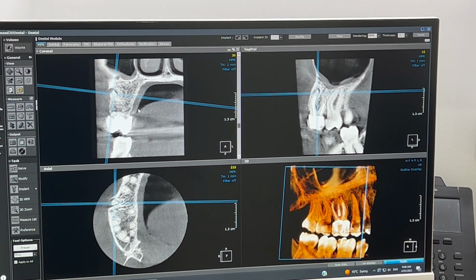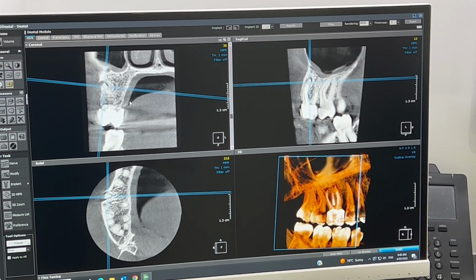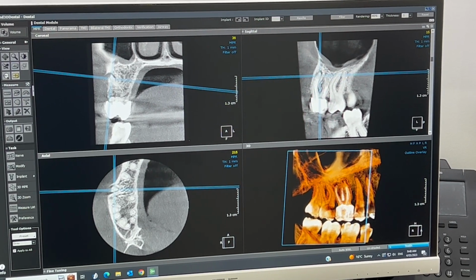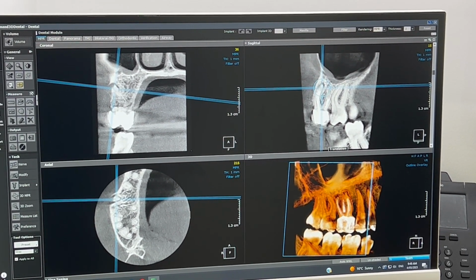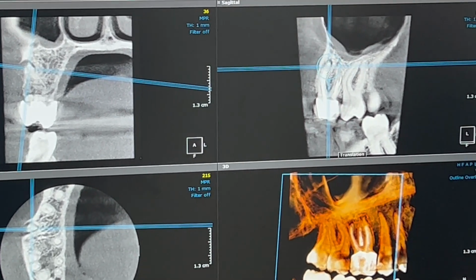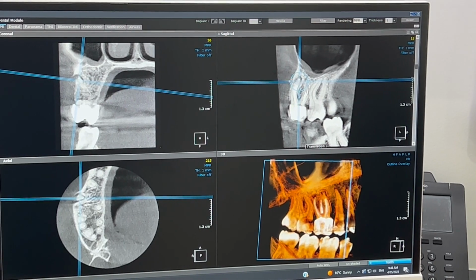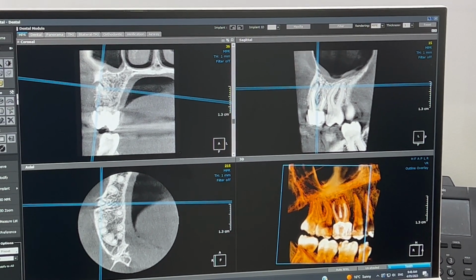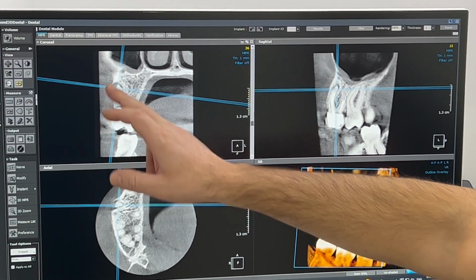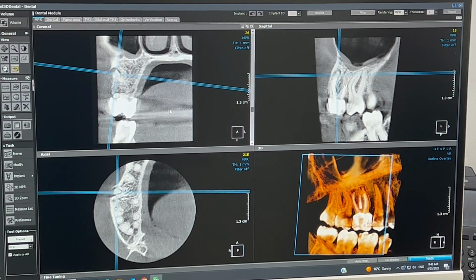again a small field of view with about 3 teeth in the range that we were looking at, and basically on CT straight away you could pick up and see either a little bit of a vertical root fracture or a chronic infection at the tip of that tooth, and it quite well shows that up there. So we can see around that buccal root, there's quite a lot of the wall of the buccal bone that's basically eroded and missing, and when you look at that on CT scan, it's obvious.